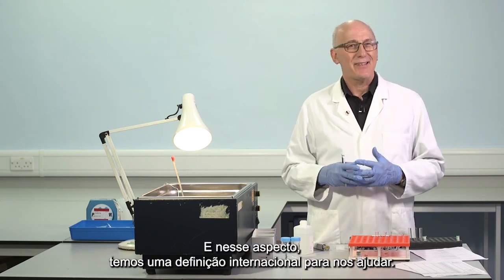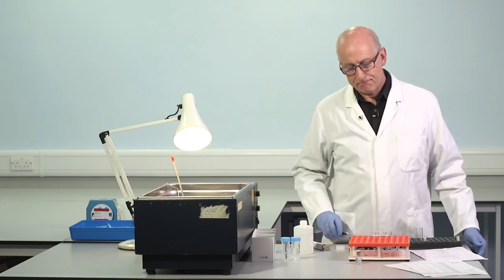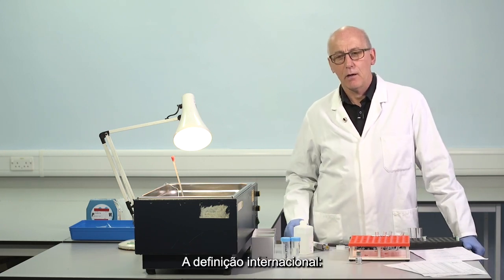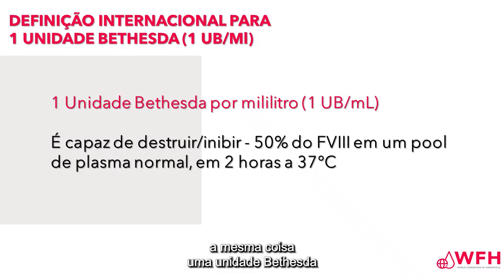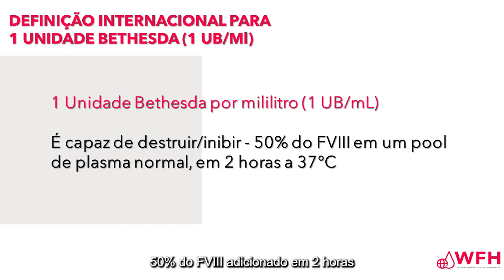And in that respect, we have an international definition to help us. The international definition: 1 Bethesda unit, Nijmegen and Bethesda the same, 1 Bethesda unit of factor VIII inhibitor inhibits 50% of the added factor VIII in 2 hours at 37.